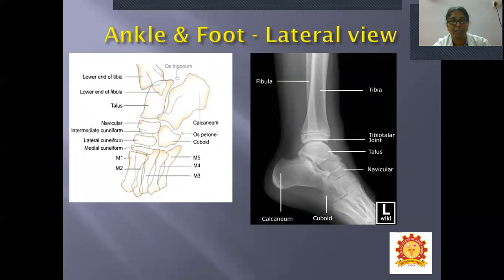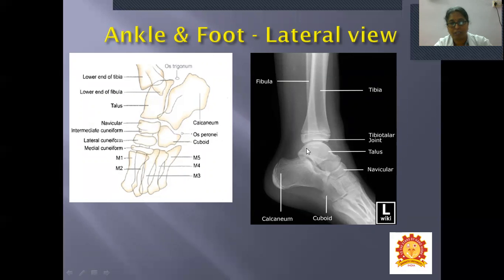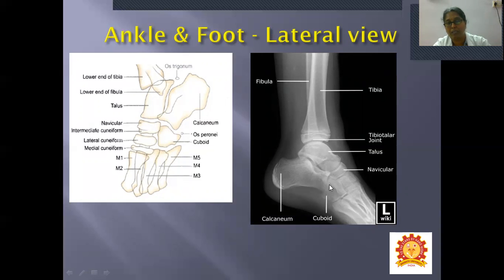In the lateral view of the ankle and foot: the lower end of the tibia is seen with the fibula deep to it as a slim structure. The ankle joint space is visible. The dome-shaped talus lies below. In front of the talus is the navicular; the calcaneum projects backwards to form the heel, and in front of the calcaneum is the cuboid.